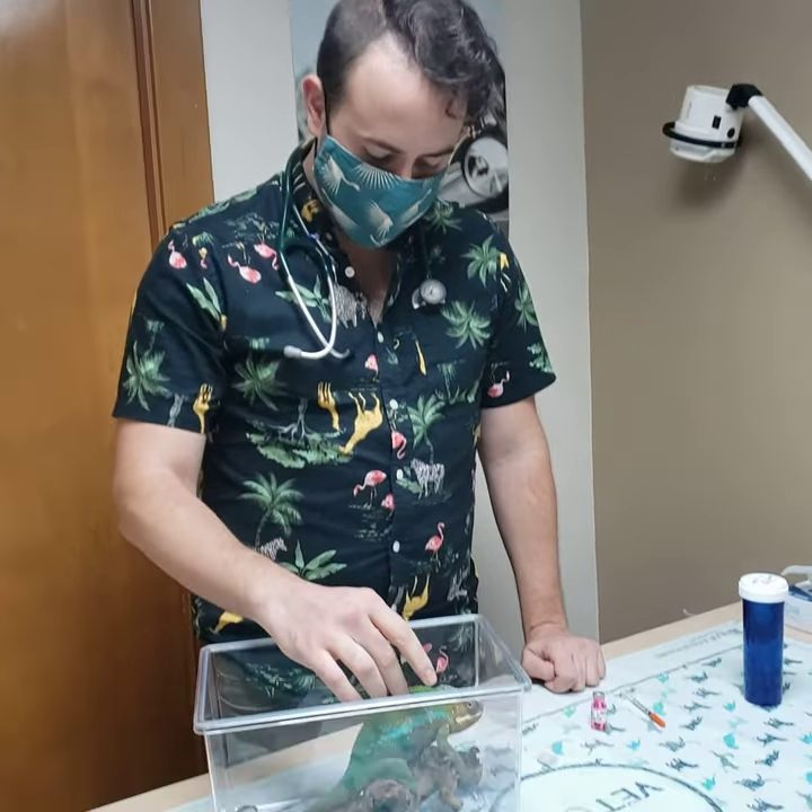Hey, this is Dr. Klein at Niles Animal Hospital, and today we're going to demonstrate injection of an antibiotic via the subcutaneous or intramuscular route on a panther chameleon.